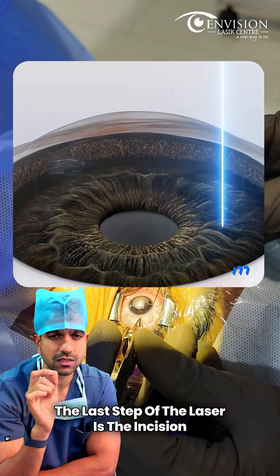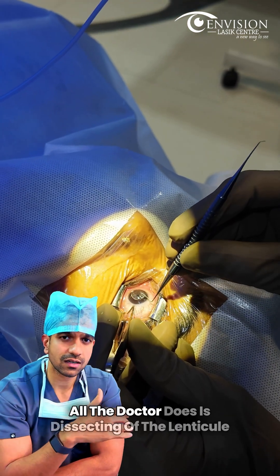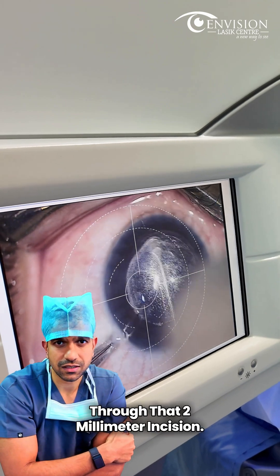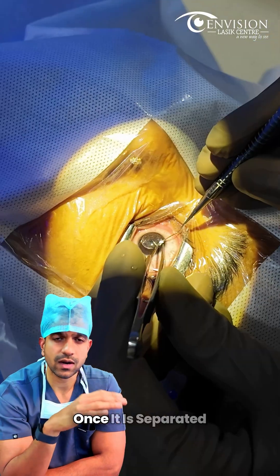Once the lenticule is created, the last step of the laser is the incision, which is about 2 to 4 millimeters. Once this is completed, the doctor dissects the lenticule on top and bottom, then removes it through that 2 millimeter incision. Once it is separated, we remove the lenticule and that's it.